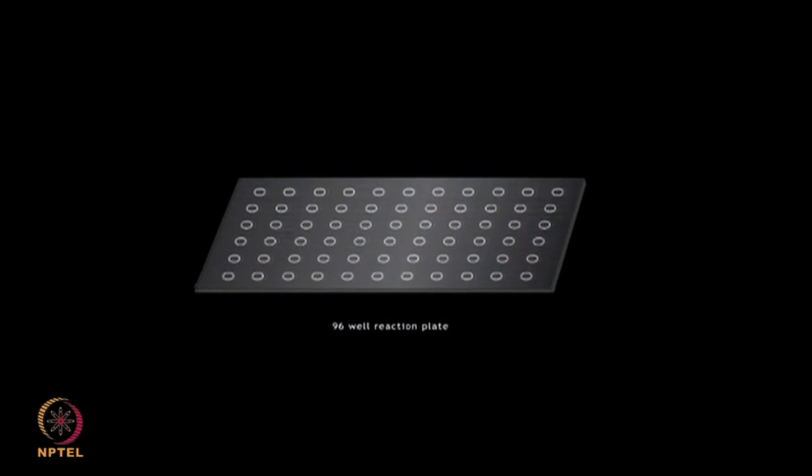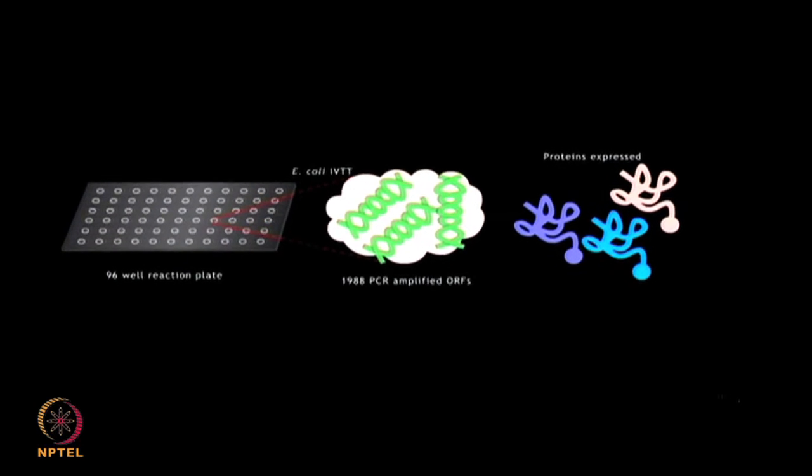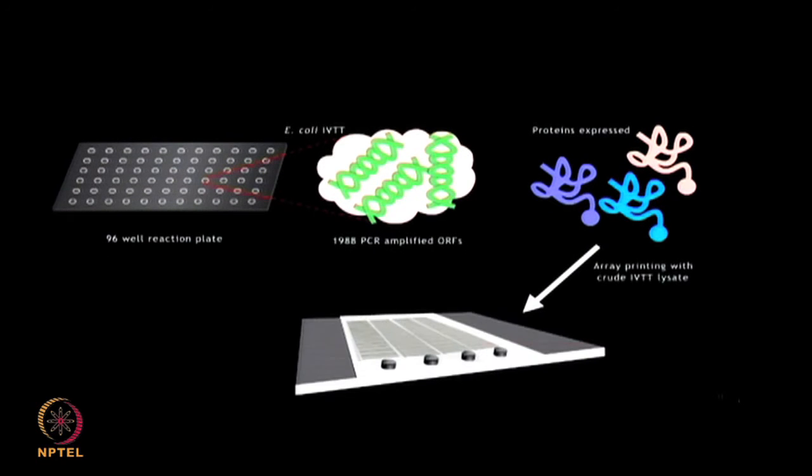Case study 4: Identification of immunogens of Q fever caused by Coxiella burnetii. Study by Beer et al. 2008. Beer et al. carried out in vitro transcription and translation of 1988 open reading frames of C. burnetii by using E. coli based cell-free systems.